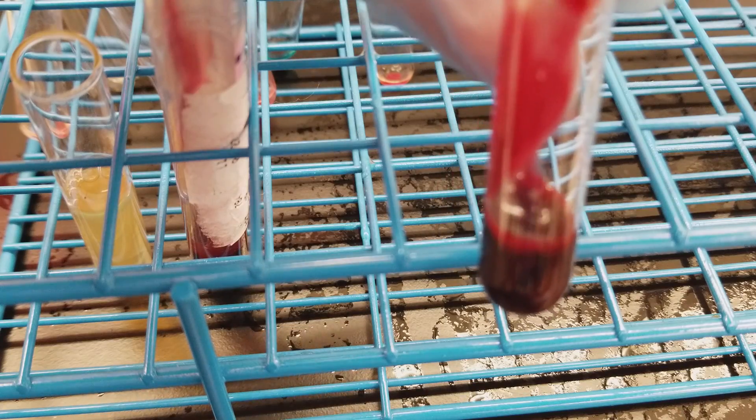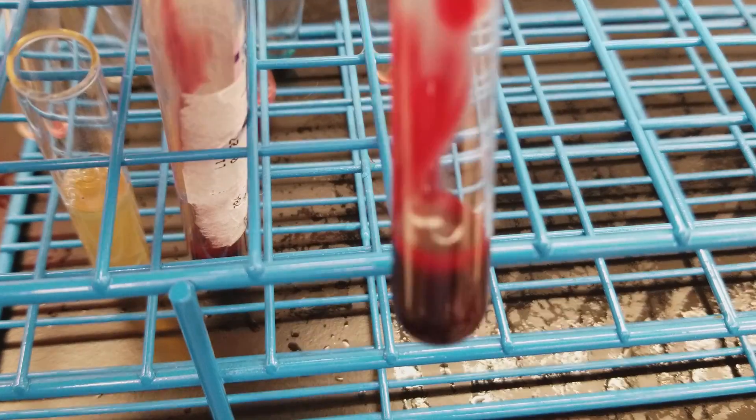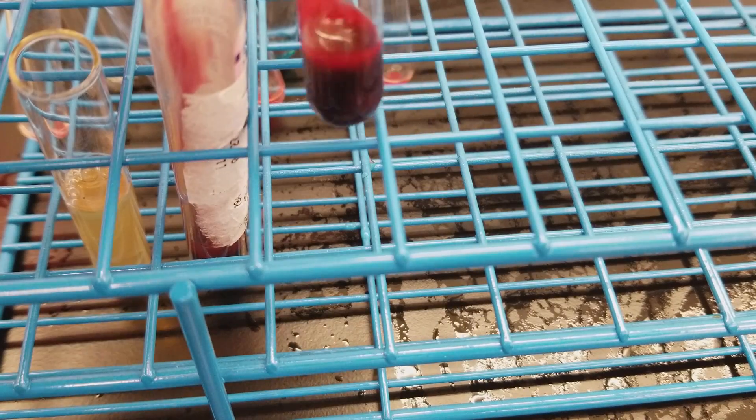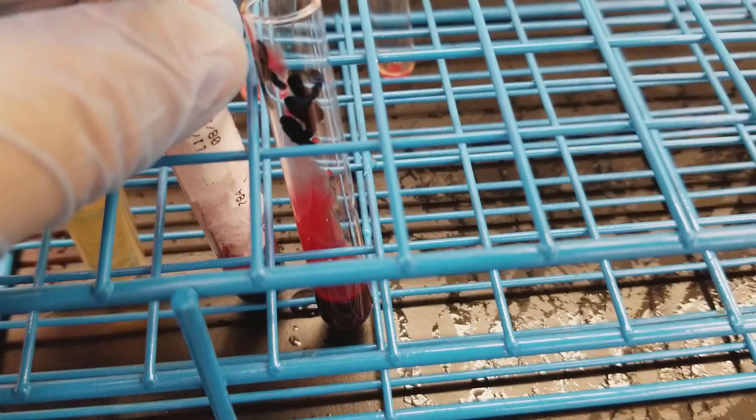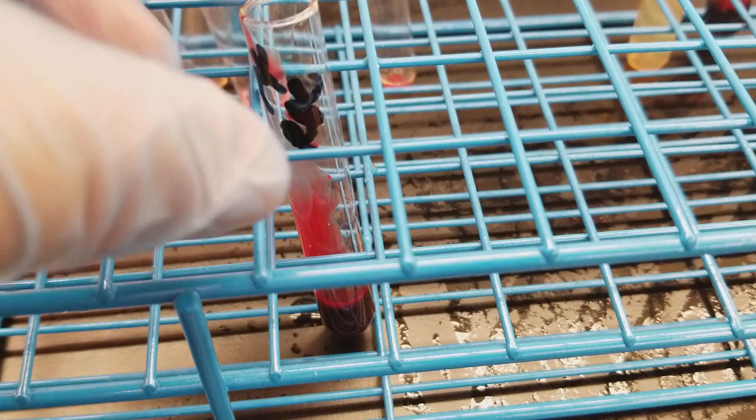So this is what one milliliter of red cells looks like in the tube. These don't have any saline in them at all — it's packed red blood cells. I'm going to cap this back up and put these off to the side.